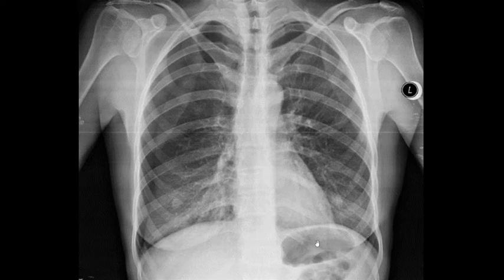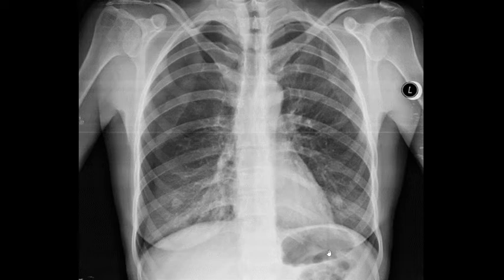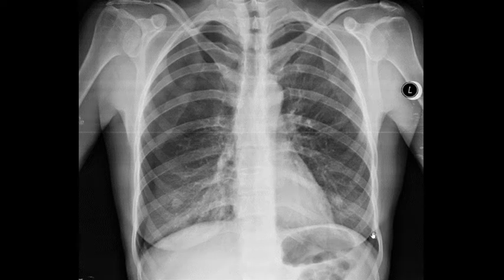Also notable here: many people, including many doctors, often wonder about this dark area — it is simply normal air in the stomach, which physiologically we always have. This is the gastric air bubble. The diaphragm extends all the way to the ribs, and the costophrenic angle should appear dark and sharp, as it does on this normal side.